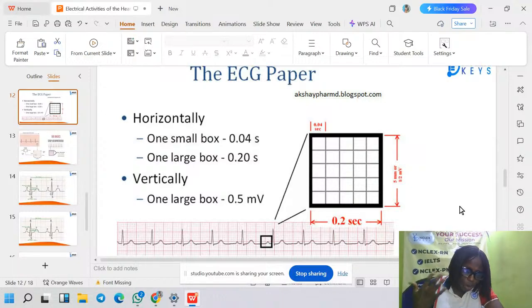Is there a way I can make it explicit enough? Count out 30 boxes from the strip. Count how many R's are within the 30 boxes.